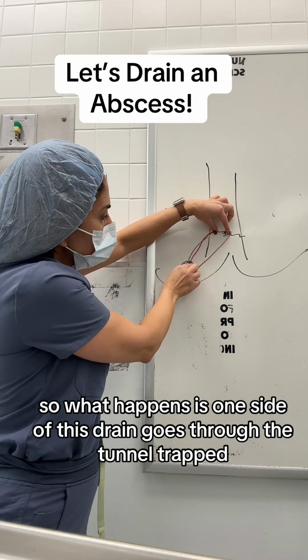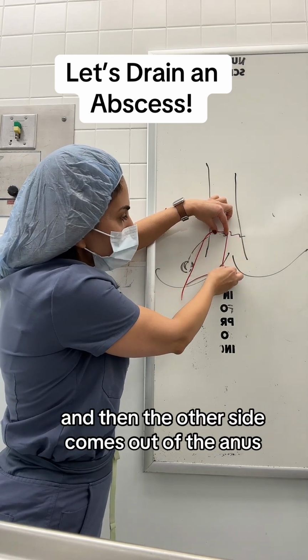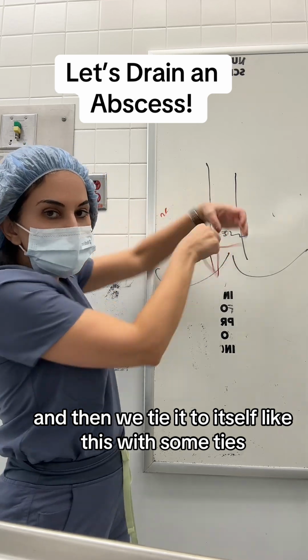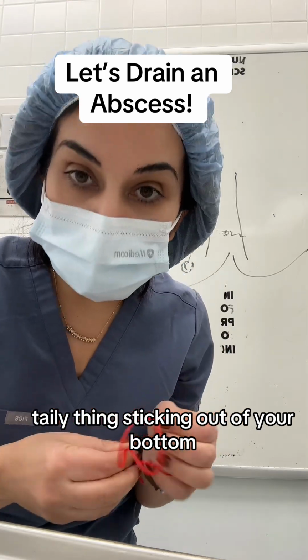So one side of this drain goes through the tunnel in the tract, and then the other side comes out of the anus, and then we tie it to itself like this with some ties. And so you end up with a little taily thing sticking out of your bottom.